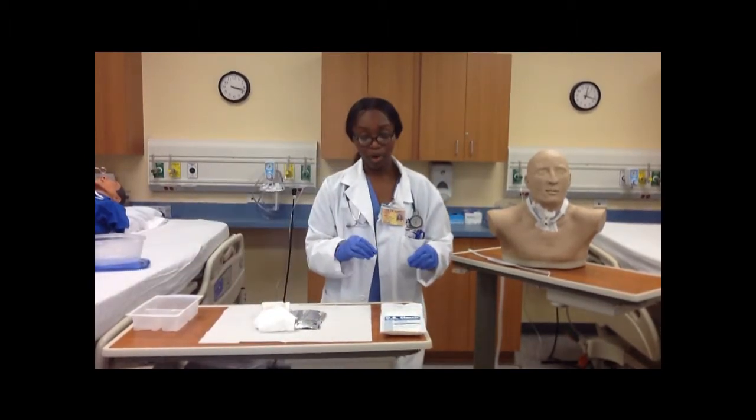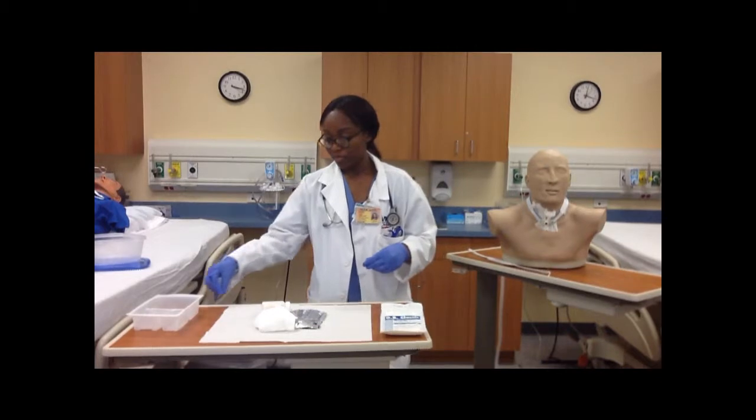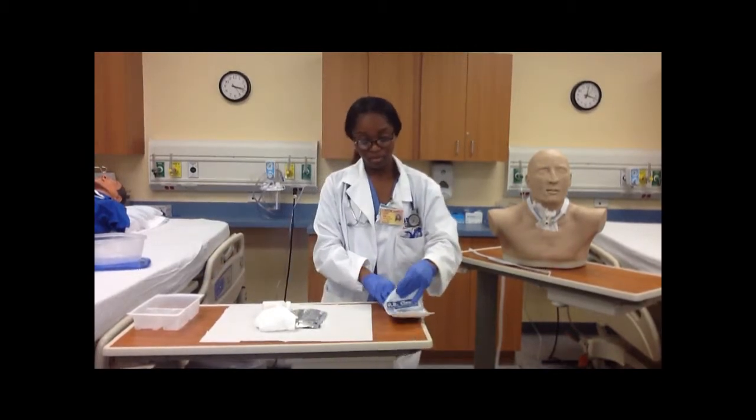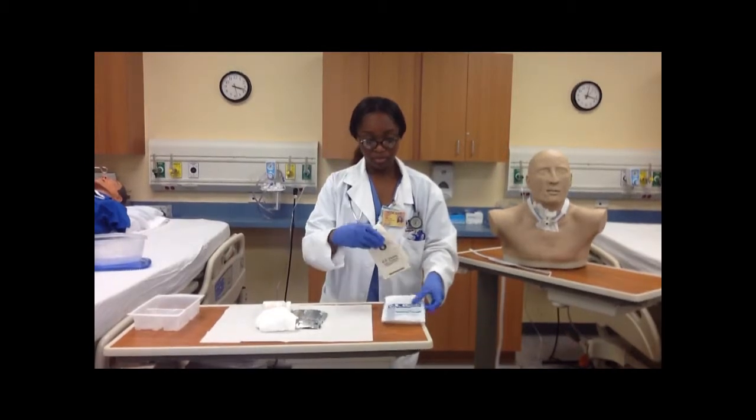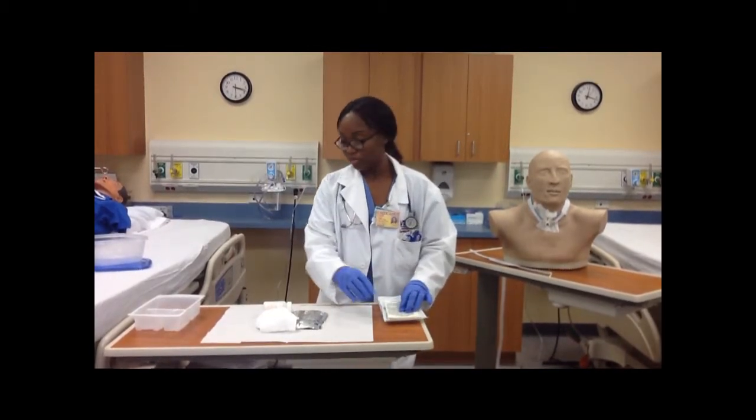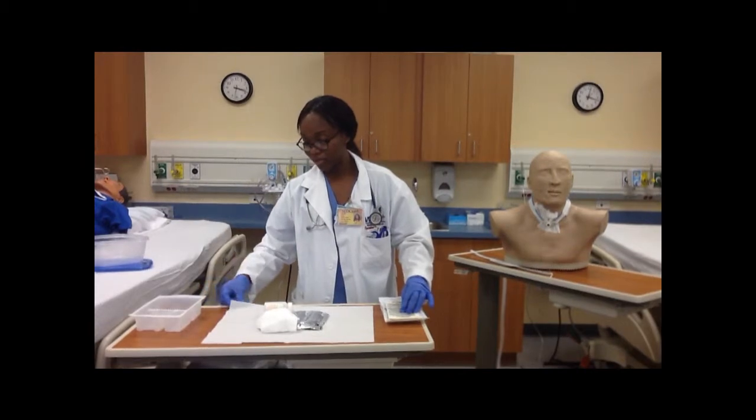Now, I'm just going to don the proper PPE. And remember to handle it from the outside.